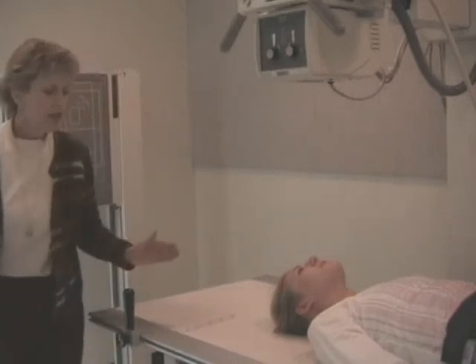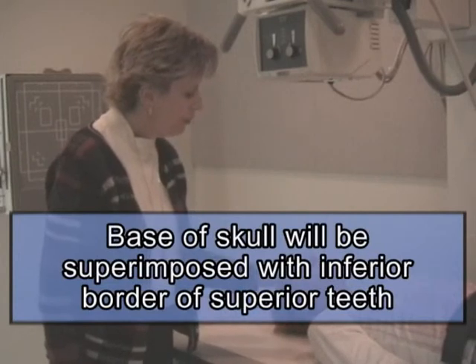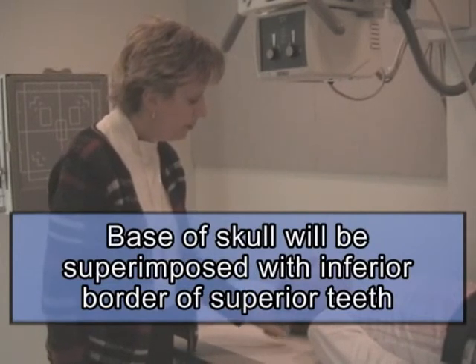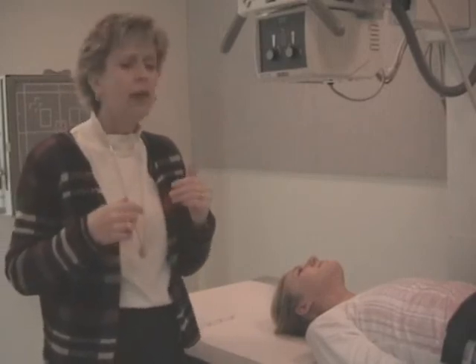If you've done a good job on this position, the base of the skull will be superimposed with the inferior border of the superior teeth. Base of skull will be lined up with the inferior border of the superior teeth, and then you will well demonstrate the odontoid process. The zygapophyseal joints on the two sides will be opened and clear, and the dens, the C2 dens, will be clear of superimposition. You'll be able to demonstrate it. And then you check for rotation. You look at the mandible and the distance between the mandible and the cervical spine and make sure it's equal on both sides.